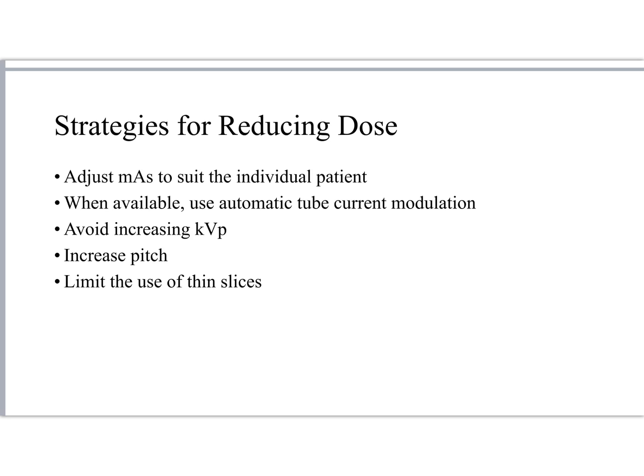Additionally, I don't know that this textbook chapter touches on it. If it does, it's very briefly. It briefly talks about newer reconstruction methods. But this is a significant thing: iterative reconstruction can significantly reduce patient dose while at the same time maintaining image quality. There are some special considerations with iterative reconstruction, and if you are interested in that, I would refer you to a lengthy article that I've written on this for the ASRT. You could just look up CT iterative dose reconstructions. I'll put a link to a citation below in YouTube.